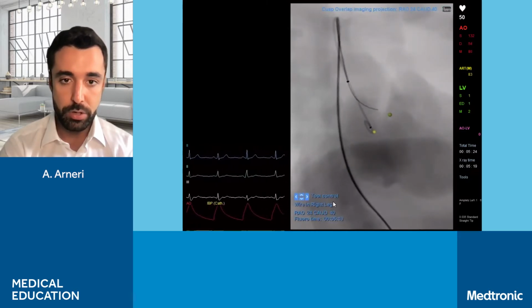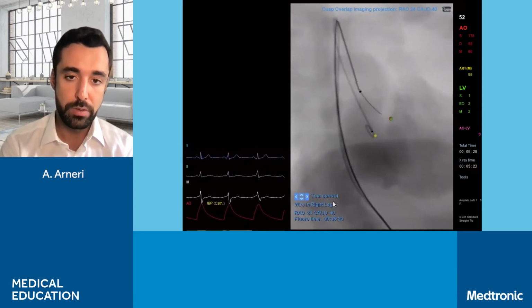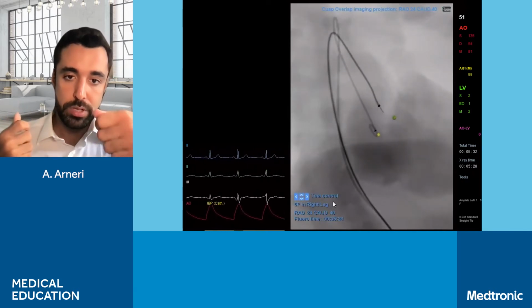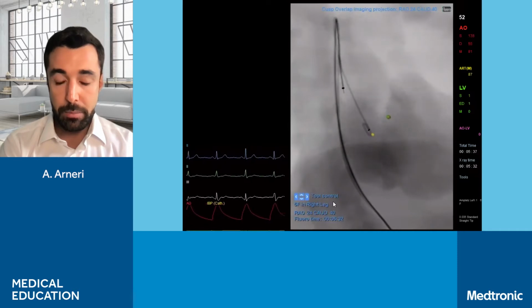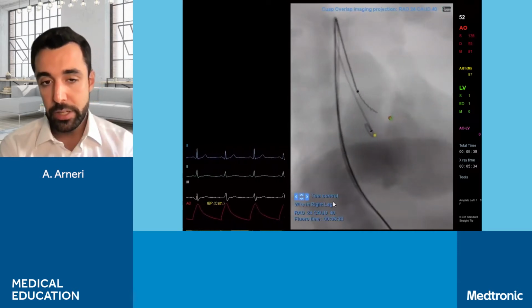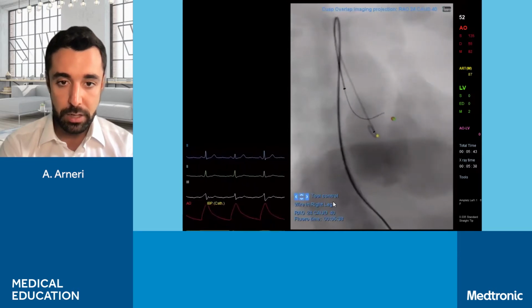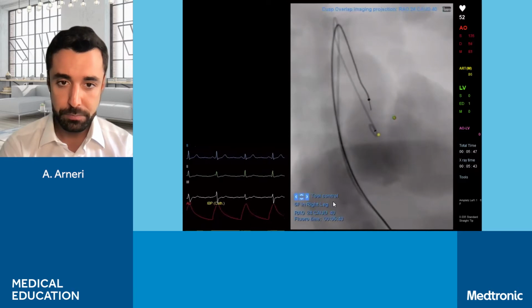ventricle. So now you see that George is pushing the straight tip wire and trying to go into the ventricle. If it's not working, he's pulling the straight tip wire back, rotating the AL1, then pushing again. It can be a really long procedure at this time if the aortic stenosis is really severe and the hole is really small. So you will need some patience.